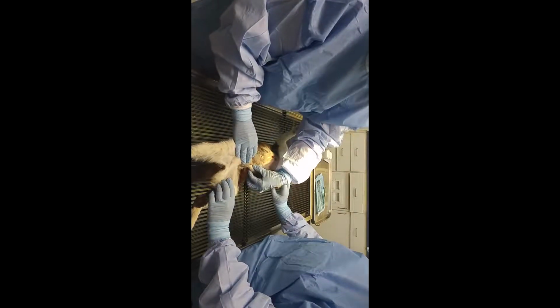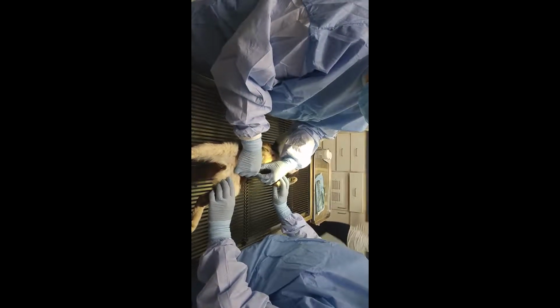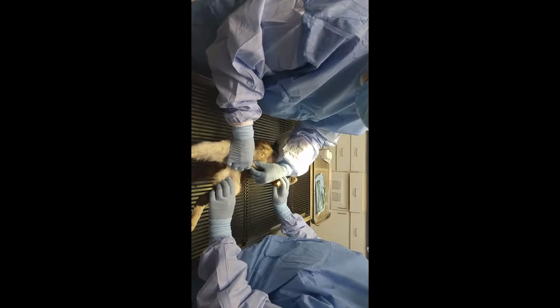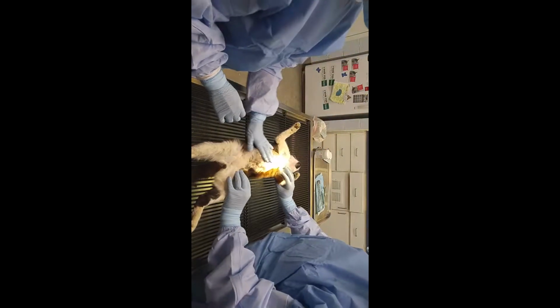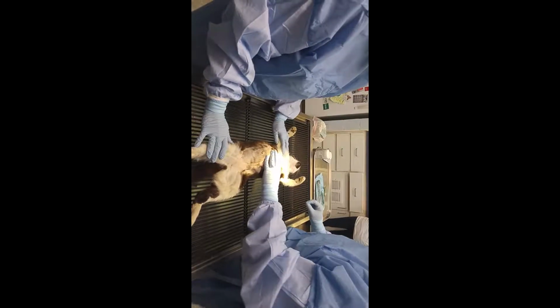Okay. You can actually see this kind of poking through right here. And that is actually lymph node, and then this right here is actually a piece of intestine that we can visibly see through her abdominal wall. That's how thick it is. Okay, so I'm going to ask Jessica to hand me a blade.